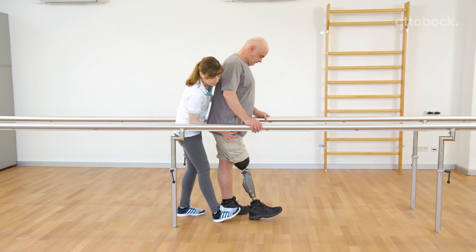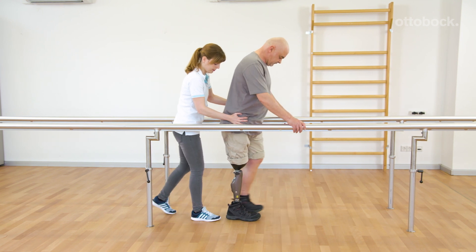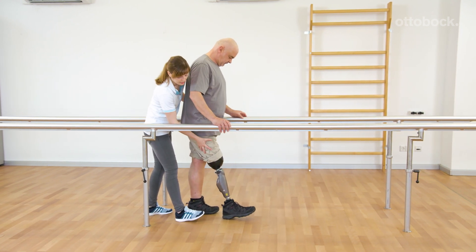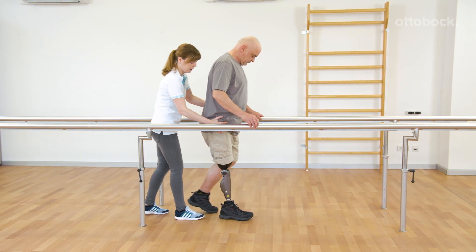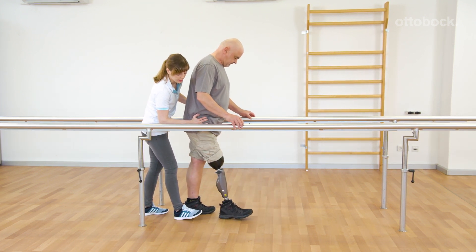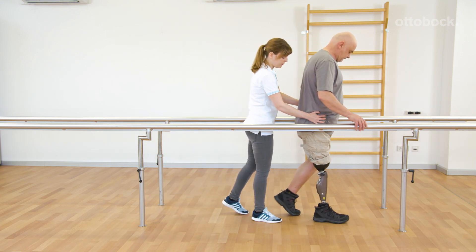While the flexion of the knee during this exercise may appear exaggerated or unnatural looking, developing stance phase knee flexion at slow speeds is a basic requirement for a secure and natural gait. Furthermore, it will help Gerhard when walking down hills later on.